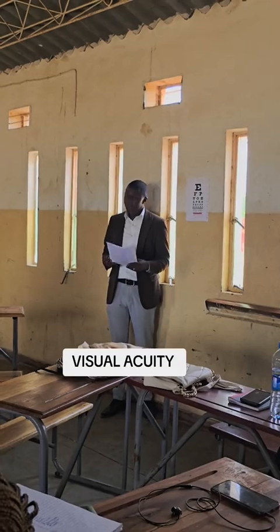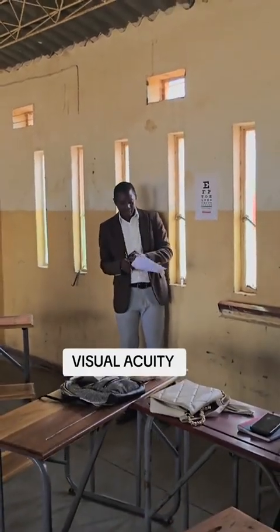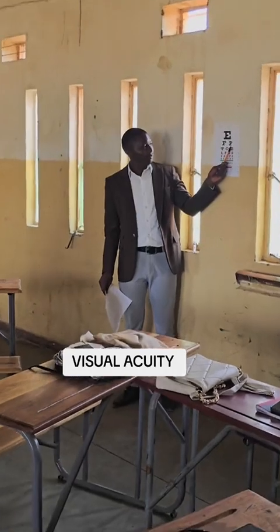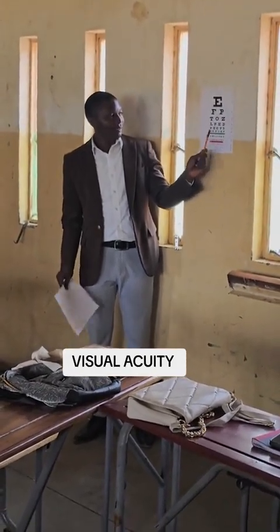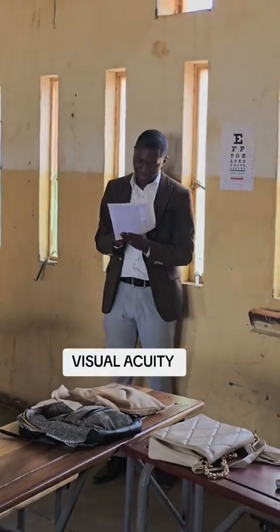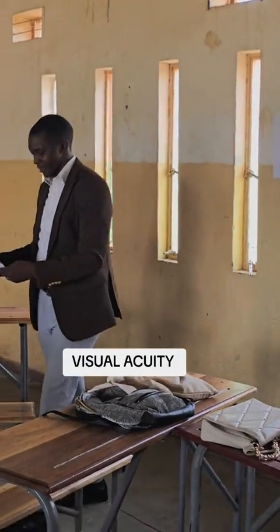So Miss X, you can now cover your right eye so that you assess your left eye. Again, what letter is this? Again, this letter. Okay, Miss X, you can come back and sit.